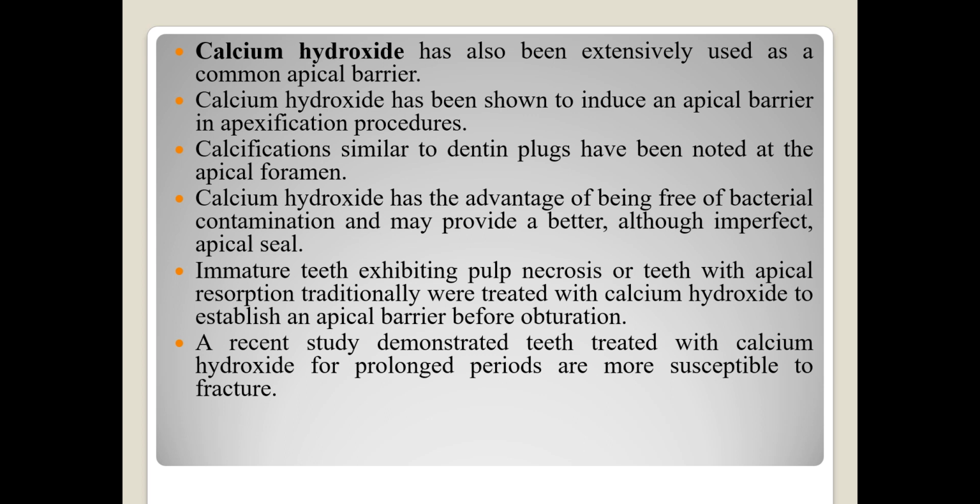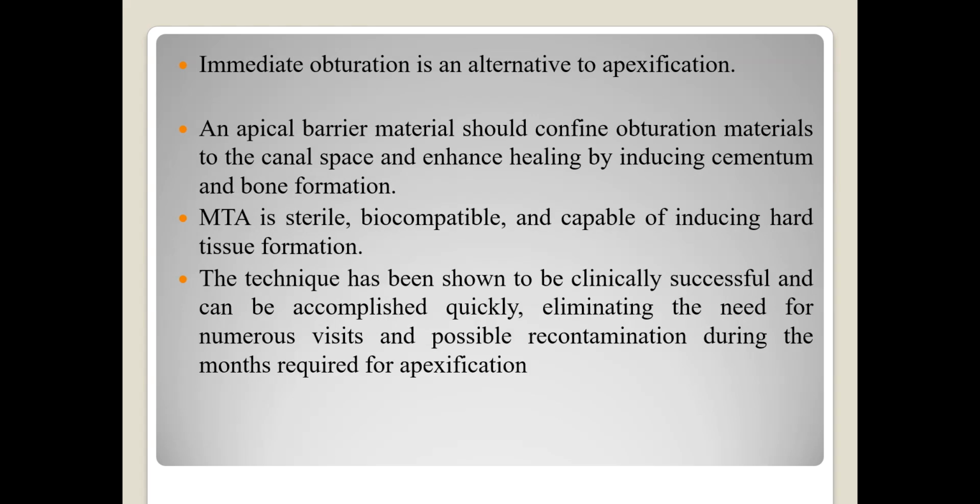Immature teeth exhibiting pulp necrosis or teeth with apical resorption were traditionally treated with calcium hydroxide to establish an apical barrier before obturation. A recent study demonstrated that teeth treated with calcium hydroxide for prolonged periods are more susceptible to fracture. Immediate obturation is an alternative to apexification.